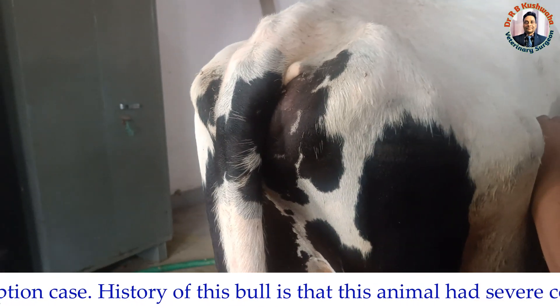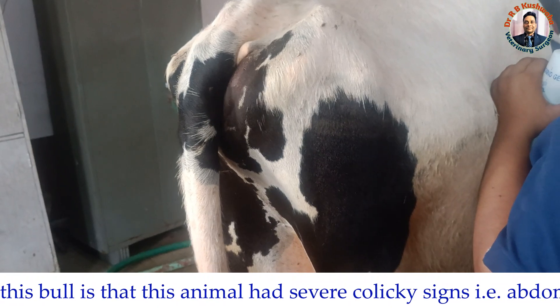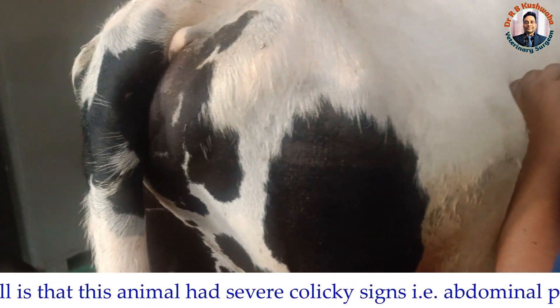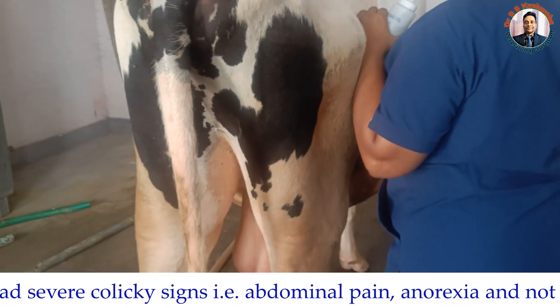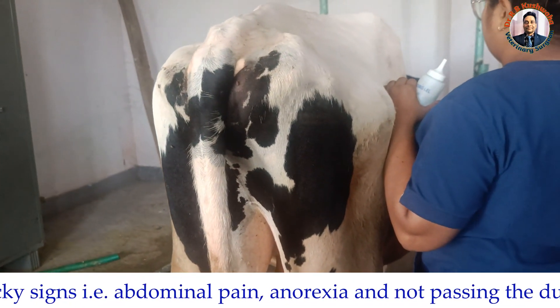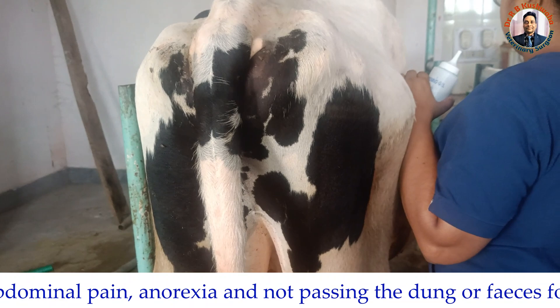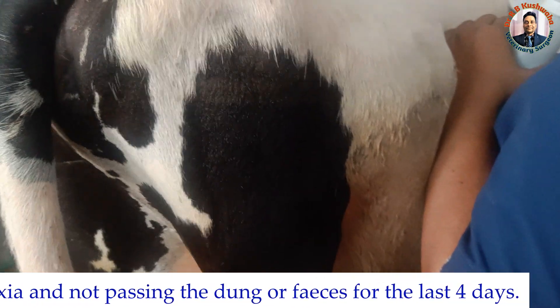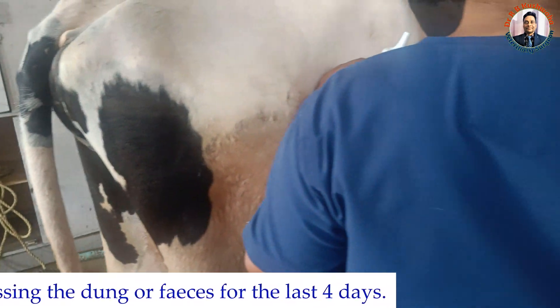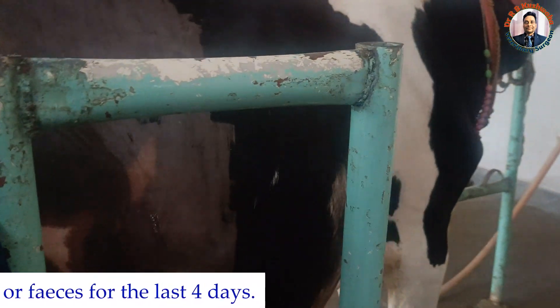Upon per-rectal examination, the rectum was empty and a mucous plug was coming. Since this is a male animal and the body size is bigger than the cow, upon per-rectal examination we were not able to palpate any mass in the abdominal cavity or towards the pelvic brim.